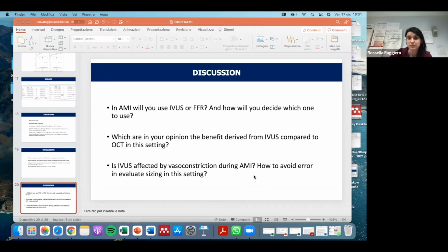In this setting, acute coronary syndrome in left main. In general, as Prof said, physicians are afraid to perform, not afraid, but it's not a priority to perform IVUS in acute coronary syndrome. In general, the literature is very scarce because there are very, very few papers, all retrospective with few patients. Prospective, I didn't find any, and the retrospective were very, very few.